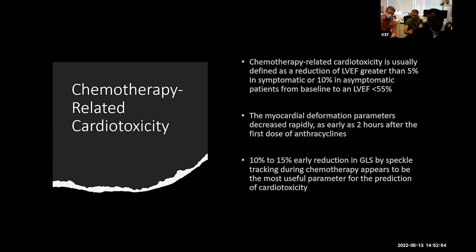And Gloria used that over E prime. Instead of using the E over E prime, she used the strain rate E, and she estimated that was the most accurate way of assessing it. That has not been validated, just like every other diastolic function measure in the critically ill.